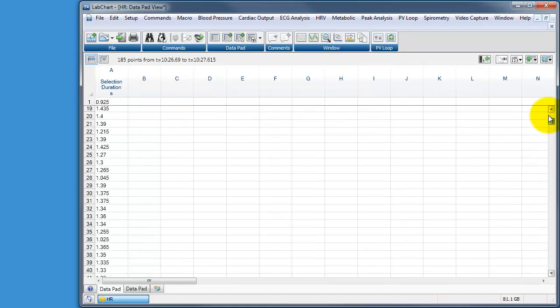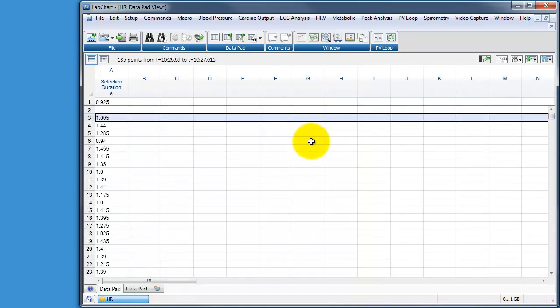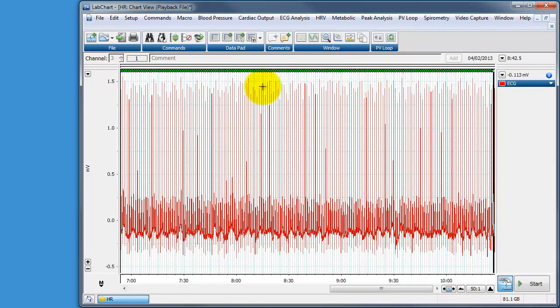So I hope that helps. That just shows you what you can do with macros. The only thing you need to be aware of with macros when using a lab chart is the macro is saved in the lab chart file. So if you wanted to use this macro in future analyses, you'd have to save the macro in one of the template files. Or save this file as a template file. Use that template to do your recording. And then you're able to use that macro for analysis at the end. And I use many of these little macros just for doing quick measurements.